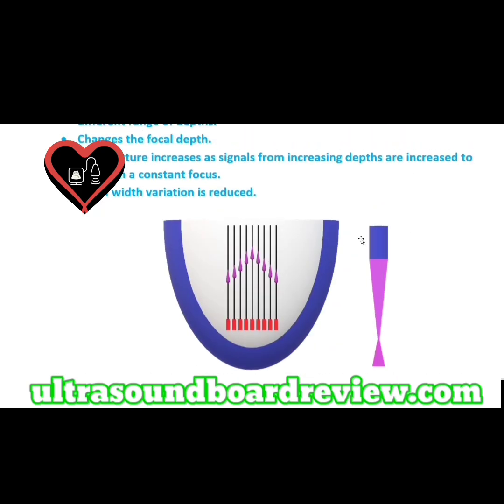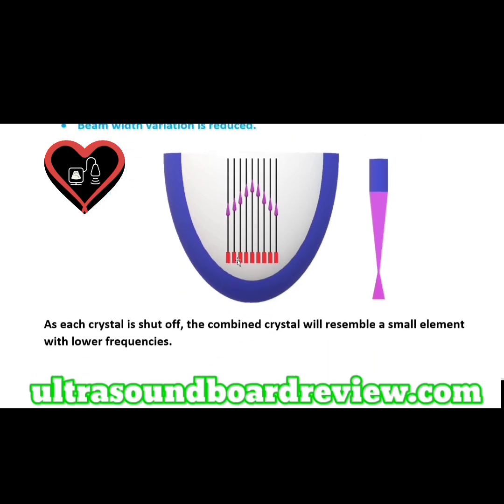When we use all the crystals, it's essentially the same thing as high frequency, but in reality, when you increase your frequency, not using dynamic aperture, you're going to decrease your penetration. So ultrasound can't penetrate the higher your frequency goes.